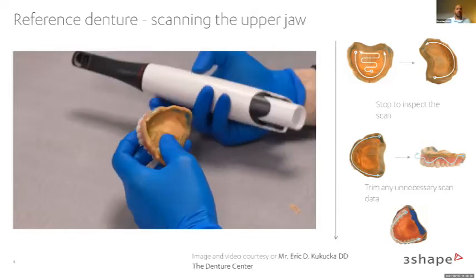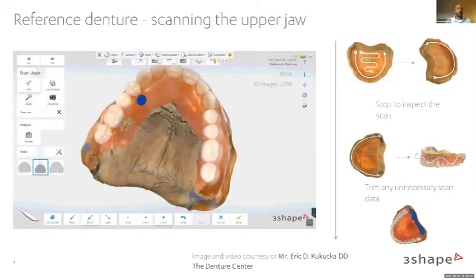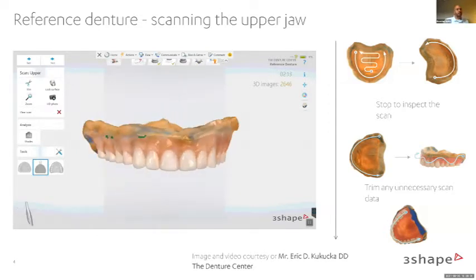You can typically do these with a patient who has existing dentures in 2 to 3 appointments. So if you need to do a try-in of the new denture, you can do a try-in directly from this scan. It's also an advantage because when you take an impression inside the denture, you can cut the borders down a little bit and get a border molded impression as well, which is really important. You can have them do their sounds and their lip, tongue movements and everything from this impression. So the try-in should fit really well, and then you're just checking the vertical dimensions and the aesthetics of the new denture. If everything's good there, then you can go into the final denture.